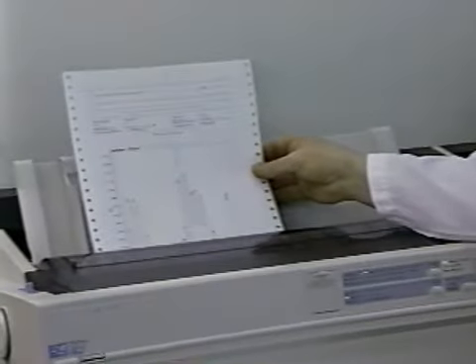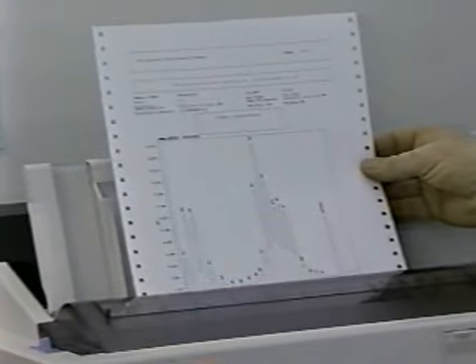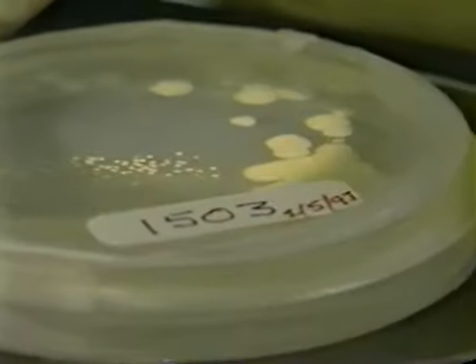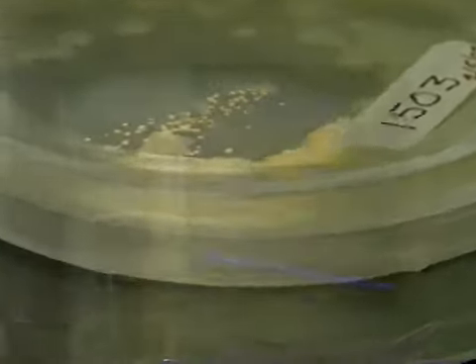Instead of detecting and identifying the true pathogen, it might be the identity of the contaminant that would be recorded in the patient's records and reported to the physician. It is therefore imperative that the species of Mycobacterium identified from the specimen actually originate with the patient. Always check the isolate to make sure you are working with a pure culture before you perform identification tests.